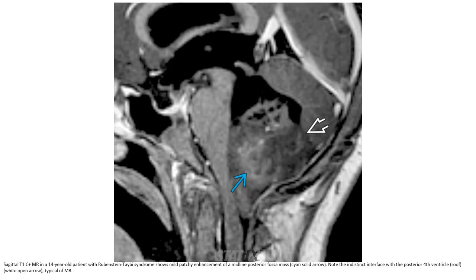MRI with contrast in a 14-year-old patient with Rubinstein-Taybi syndrome shows heterogeneous enhancement of the midline posterior fossa mass. Note the indistinct interface with the posterior fourth ventricle, typical of medulloblastoma.